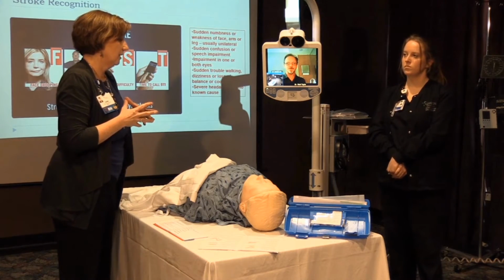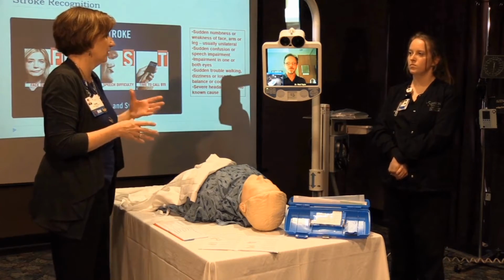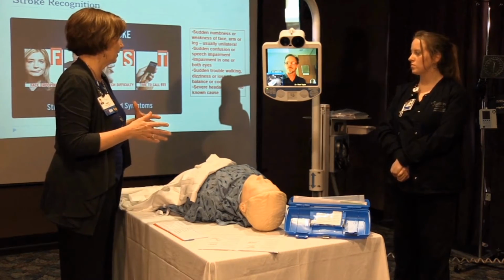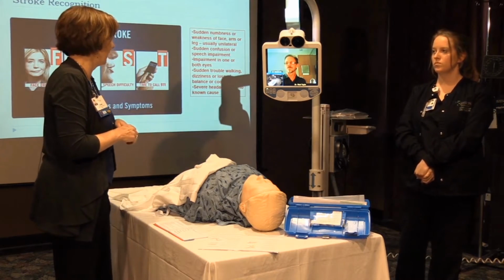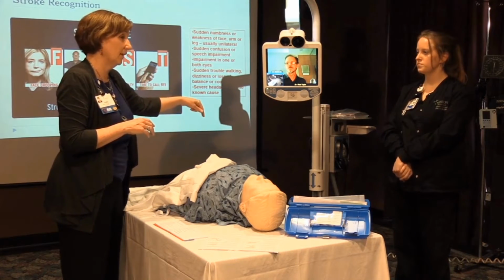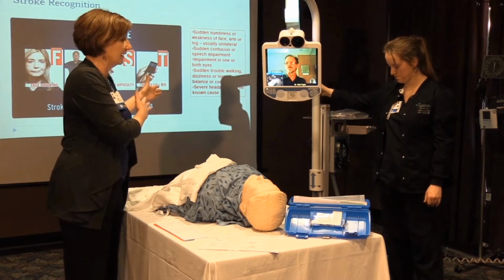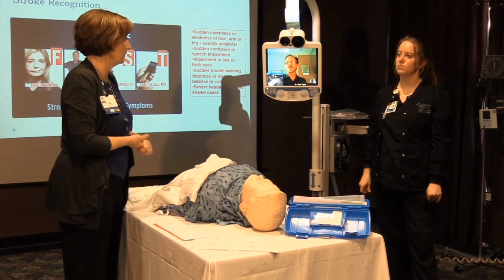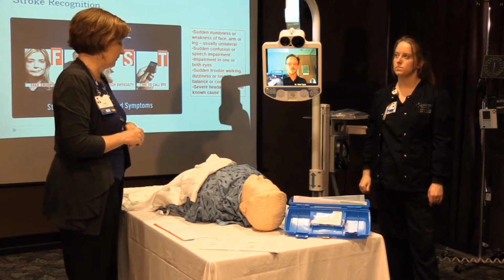Again, Dr. Taylor mentioned that he was able to get a report of the CT scan, but he may actually have to leave the room in order to go see an image from PACS, and so there may be opportunities for us to improve that turnaround. But this particular cart does not drive itself, so if he needs to go out to the main desk and take a look at images, he'll need someone to escort him to do that.